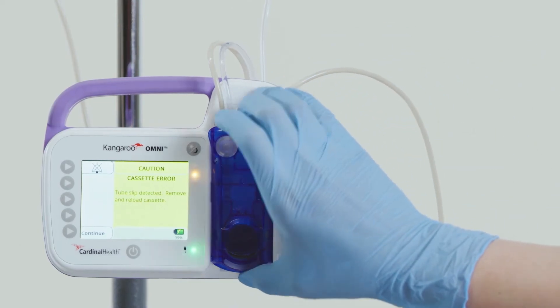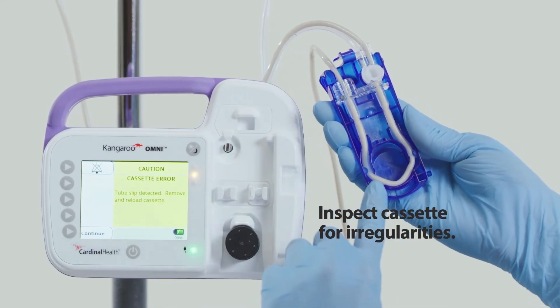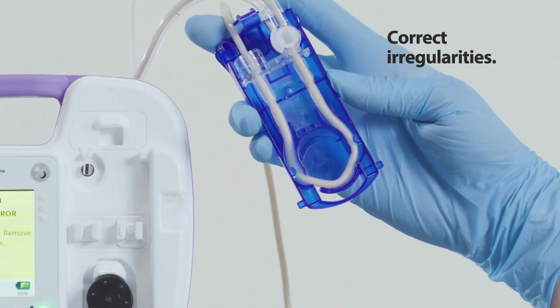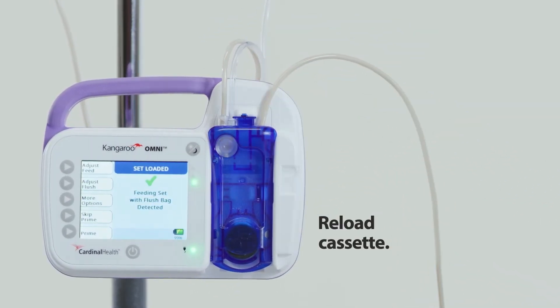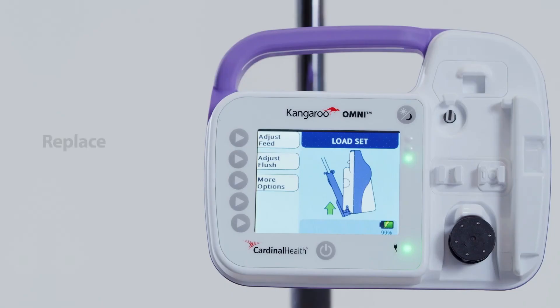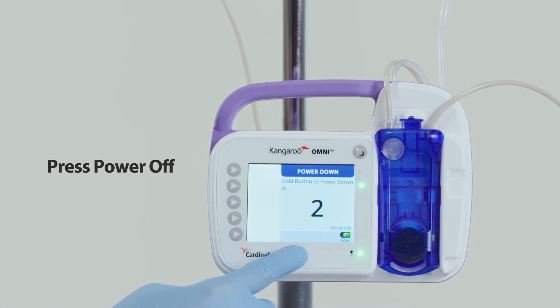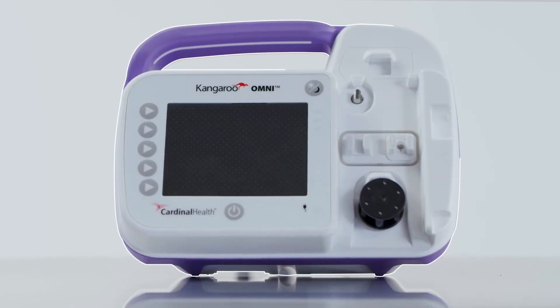To resolve the alarm, first remove the cassette. Second, inspect the cassette for irregularities. Third, correct the irregularities. Fourth, reload the cassette. If the alarm continues, replace the feeding set. If the alarm continues after replacing the feeding set, press power off and use a different Kangaroo Omni enteral feeding pump.